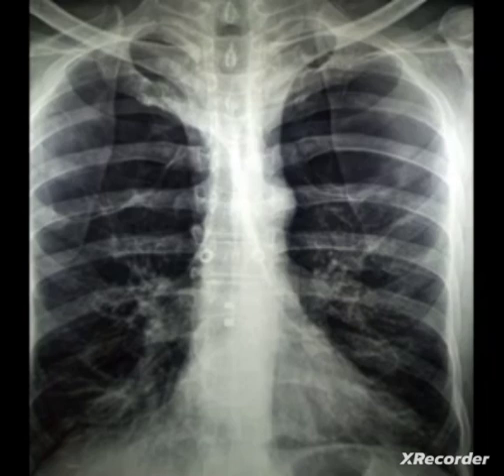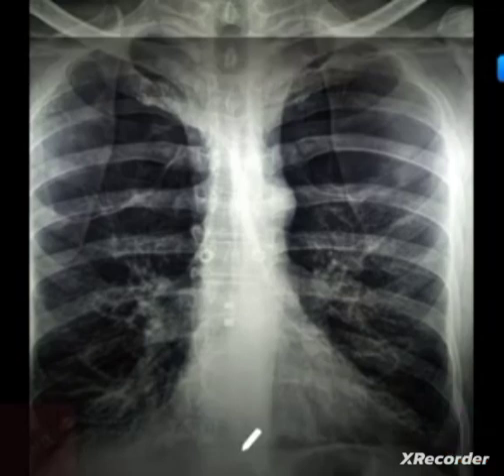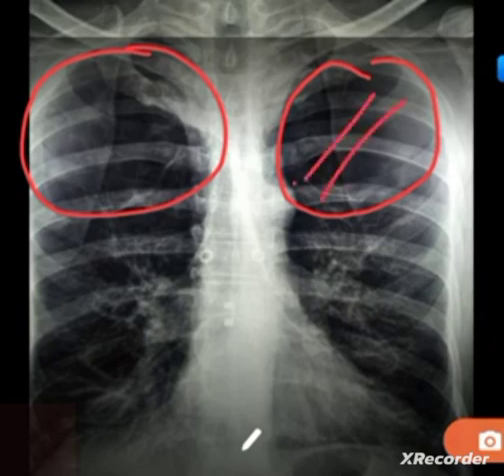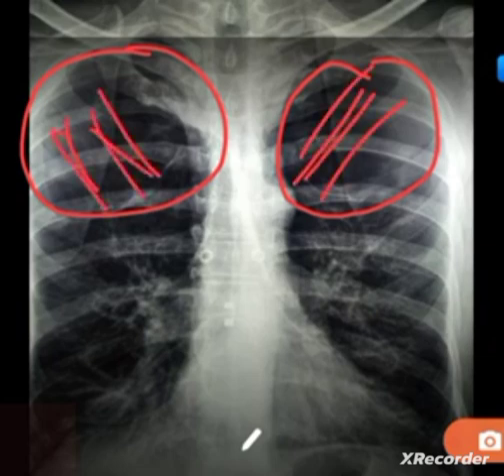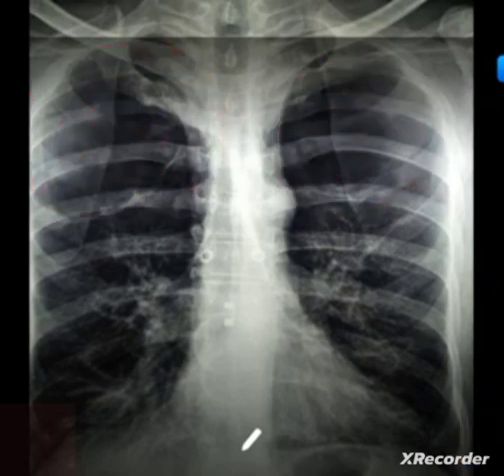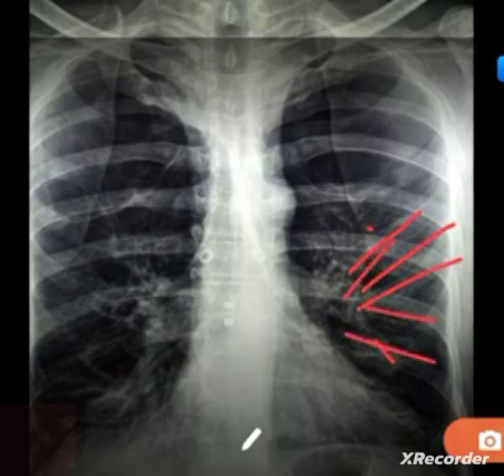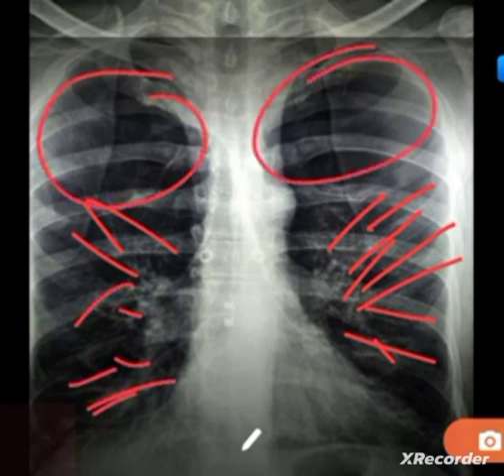Now let's look at the X-ray findings. In this X-ray you can appreciate bilaterally hyperlucent areas in the upper zones, with no broncovascular markings. You can also see white vessels in some places, but the dominant finding is hyperlucency with absent broncovascular markings bilaterally.